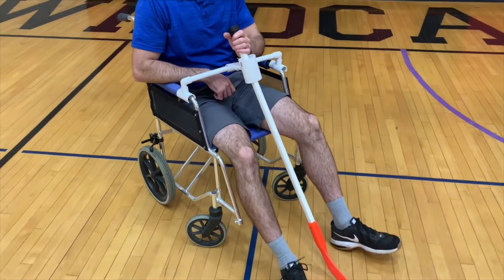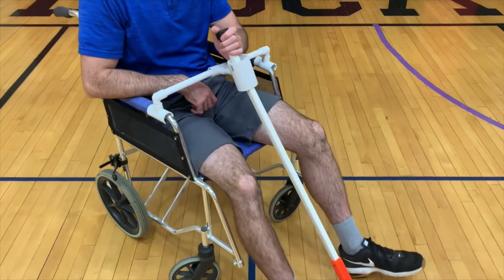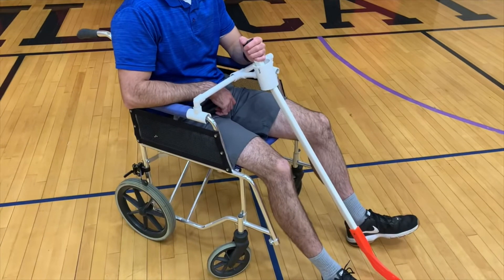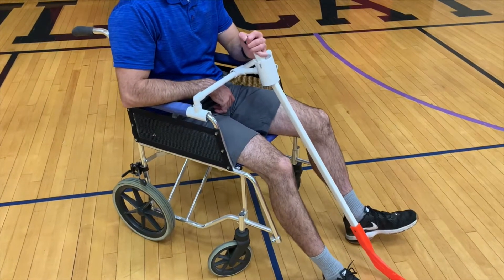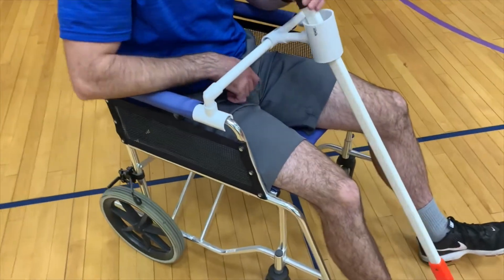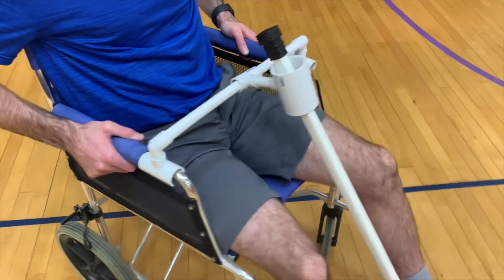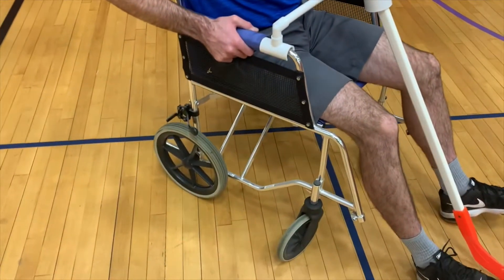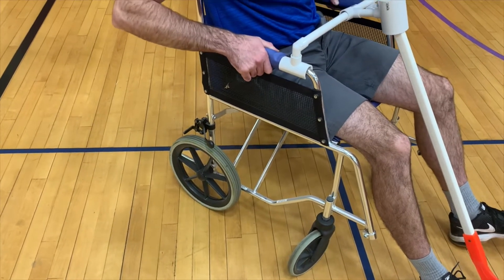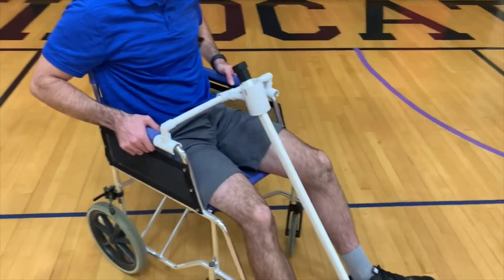Here we have the hockey stick floor hockey holder for an adaptive phys ed class. This is to help a student who may be wheelchair bound participate in floor hockey in gym class. We constructed this out of PVC pipe to hold and attach to a manual wheelchair. Unfortunately, this is the only wheelchair I had available to me, so the wheels aren't quite normal for someone to maneuver on their own, and it doesn't have foot pegs, but you'll get the idea of the invention here.